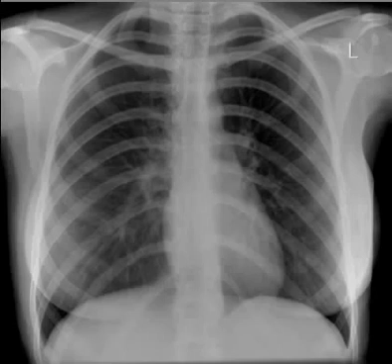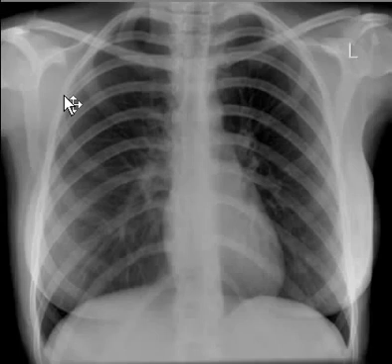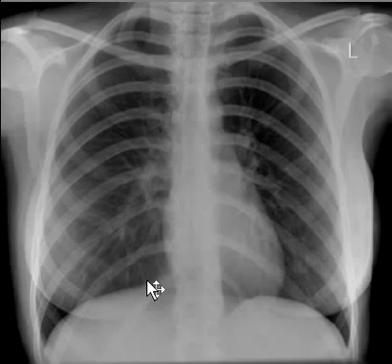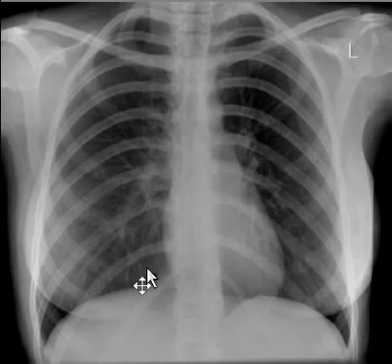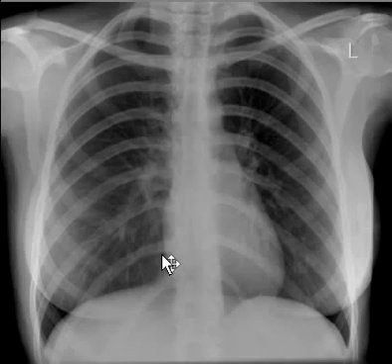Both lungs have good volume and are almost equal in size. The height of both diaphragms is at the level of the 6th anterior rib or 9th posterior rib. If there is a good breathing effort, the lung will go a bit lower.